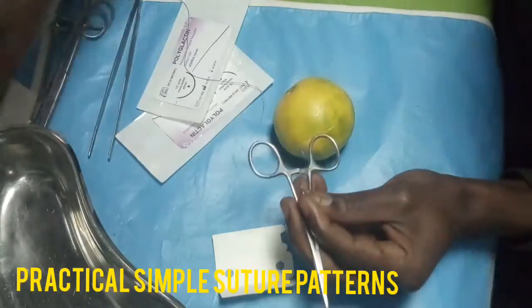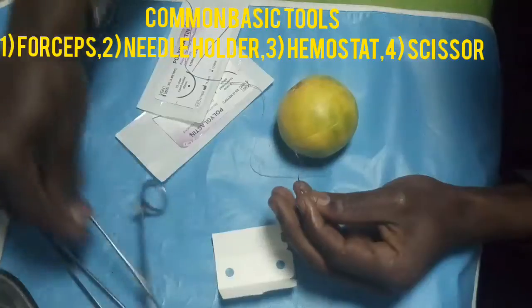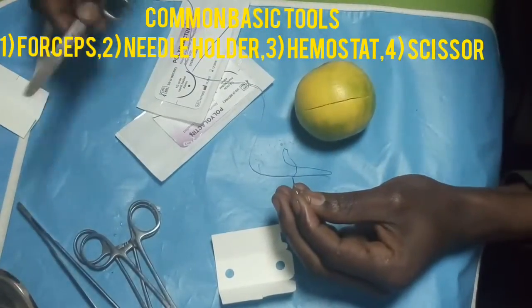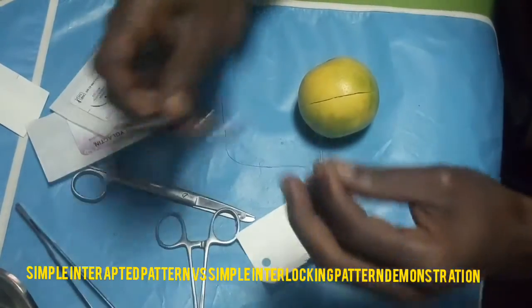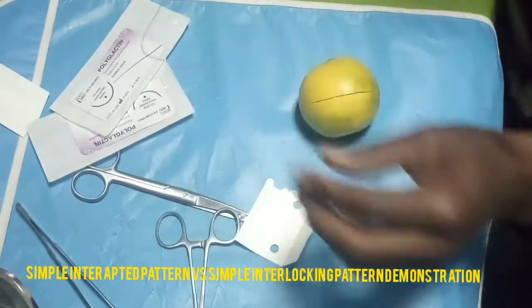Okay, remember the common tools that I said we are going to use: the forceps, the needle holder, the hemostat to arrest the bleeding, and the scissors. So we are going to demonstrate two common basic types of suture in the surgical area. The first one we said is the simple interrupted pattern.